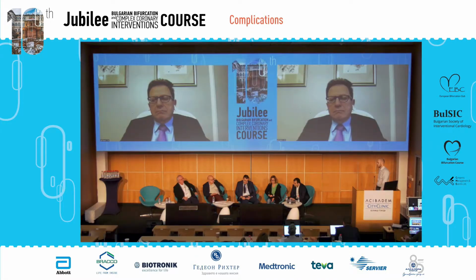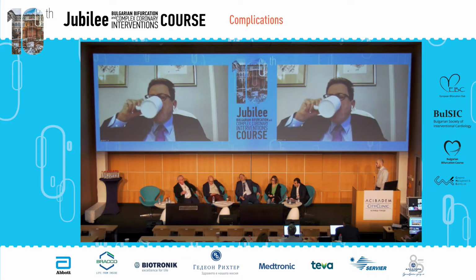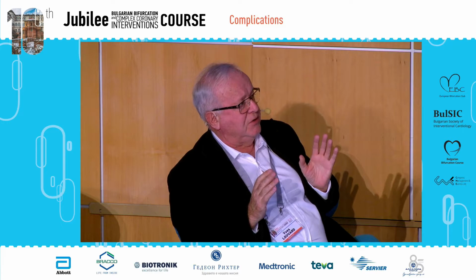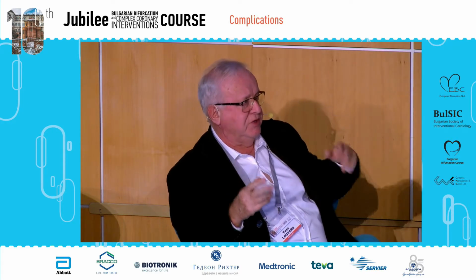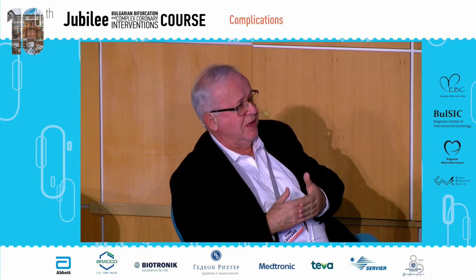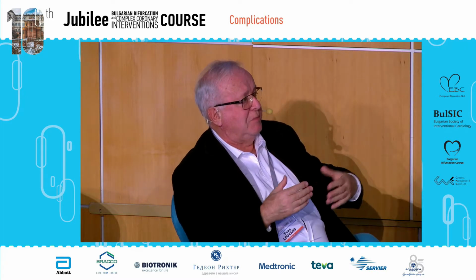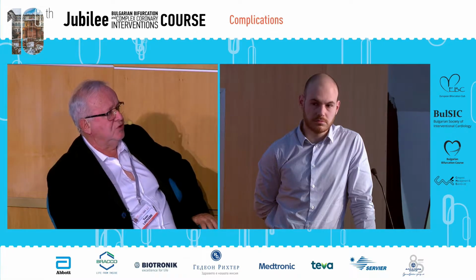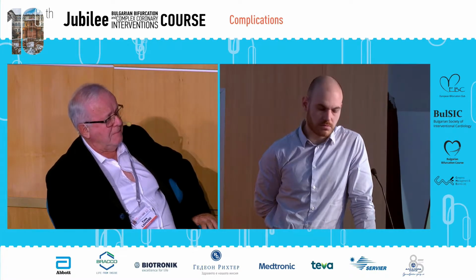Okay. And of course, it's easier, as I discussed many times in the meeting, if you do antegrade, you can manage the length of overlapping, not making a mistake of 15 overlapping. But here, I think it was certainly a better solution to stent distally.